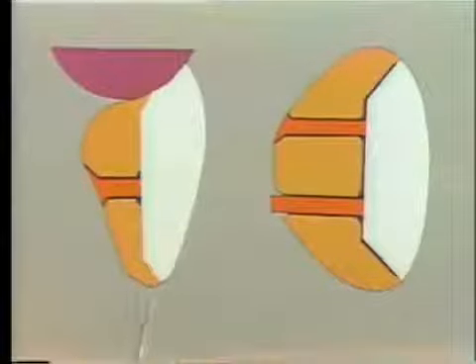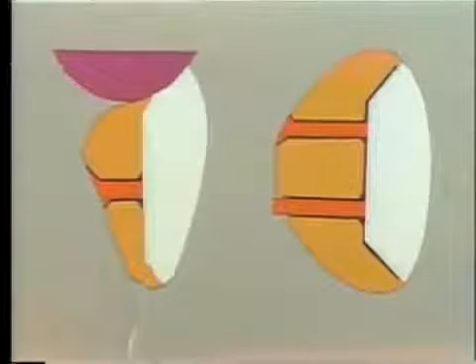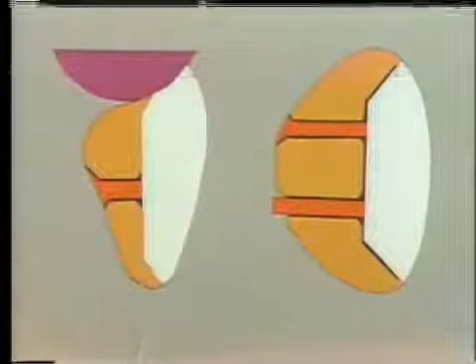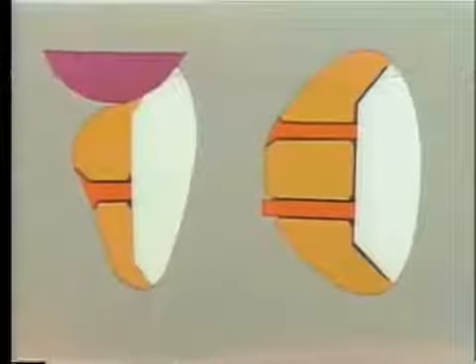Notice the incisal here, where the gold is brought down to protect the porcelain at the edge here, and how the porcelain has been hollow ground just in here to give an extra bulk of gold across the incisal edge, so that it absorbs any stresses which fall on here. I think you can see that on impact with any hard food matter, it would be the gold which would receive the first stress in this situation and not the porcelain.